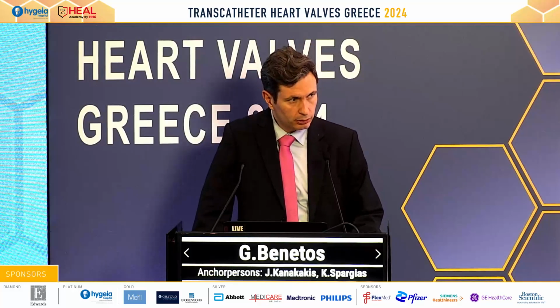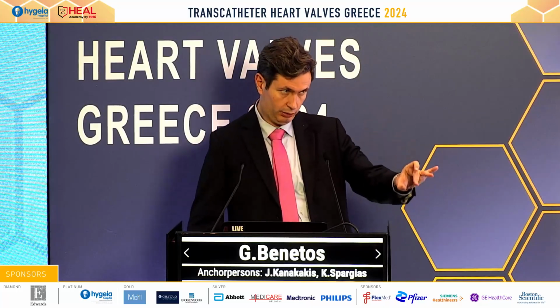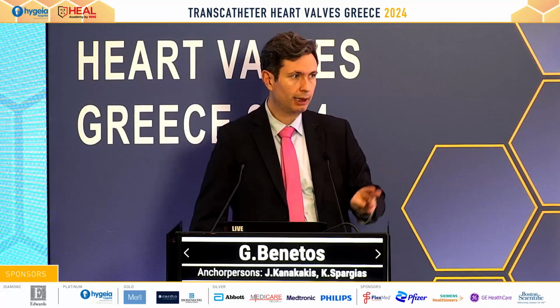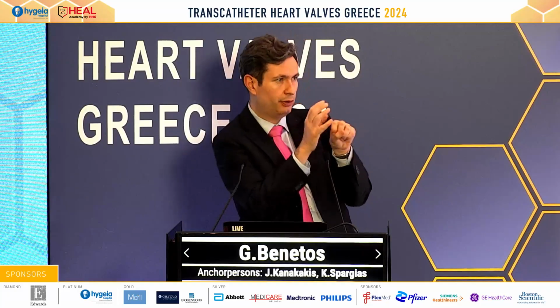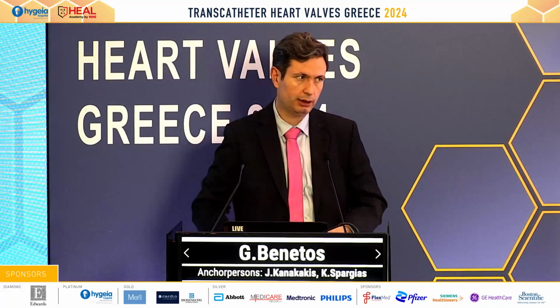I would like to ask how accurate is the measurement of the calcium in the outflow tract in order to avoid some ruptures? In calcium score scanning, it's sometimes difficult to distinguish between outflow tract calcium and aortic valve calcium. Sometimes you cannot exactly, because these are in continuum actually, these masses are connected, so it's difficult to delineate where the aortic valve stops and the outflow tract starts.